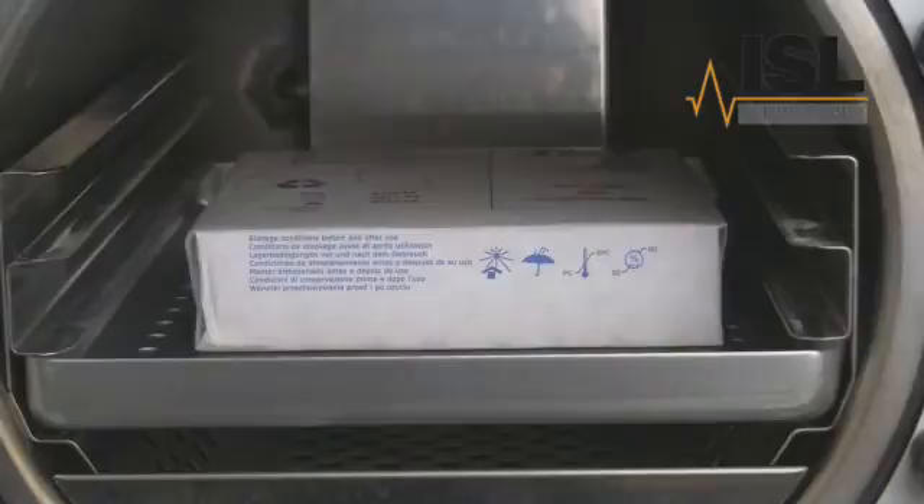Once the Bowie Dick Pack is in place, close the door and start the cycle. The Bowie Dick Pack is made up of layers of porous sheets with a sensor sheet in the middle. The machine must be able to remove all the air from the porous sheets and then push steam back in to contact the sensor sheet and change the colour of the ink.